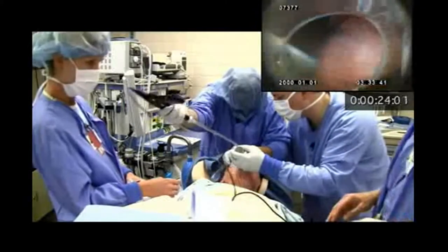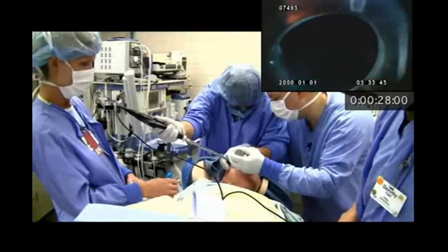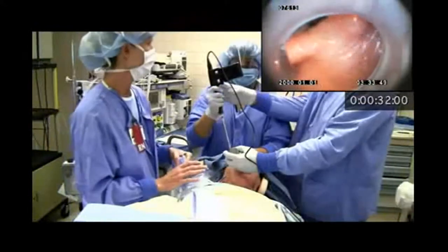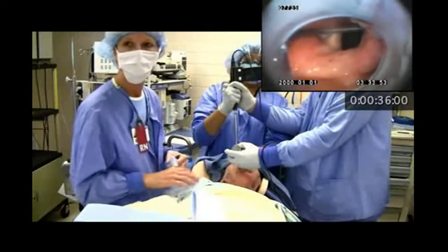Go ahead and just put this into the corner of her mouth and don't look at that screen until you wrap it around the base of her tongue here. Good. Now stand up tall and look right at her larynx. Do you see it right there? That's right. I see the cartilages.